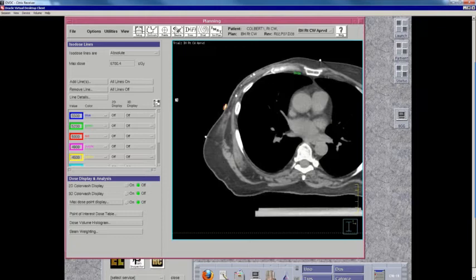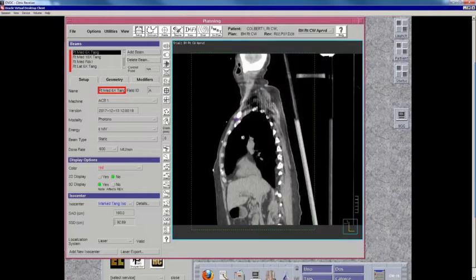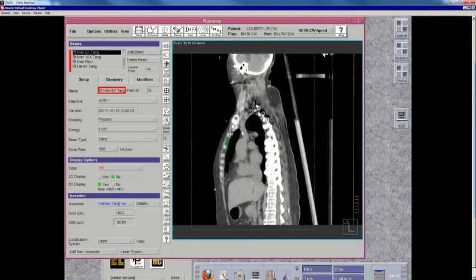If you have somebody helping you to contour these, it's very common for them to make a mistake and contour too much or too little. One very easy way to validate that is just to look at the sagittal. So here, first interspace, second interspace, third interspace. Very obvious, nice, clean way to check your contour.